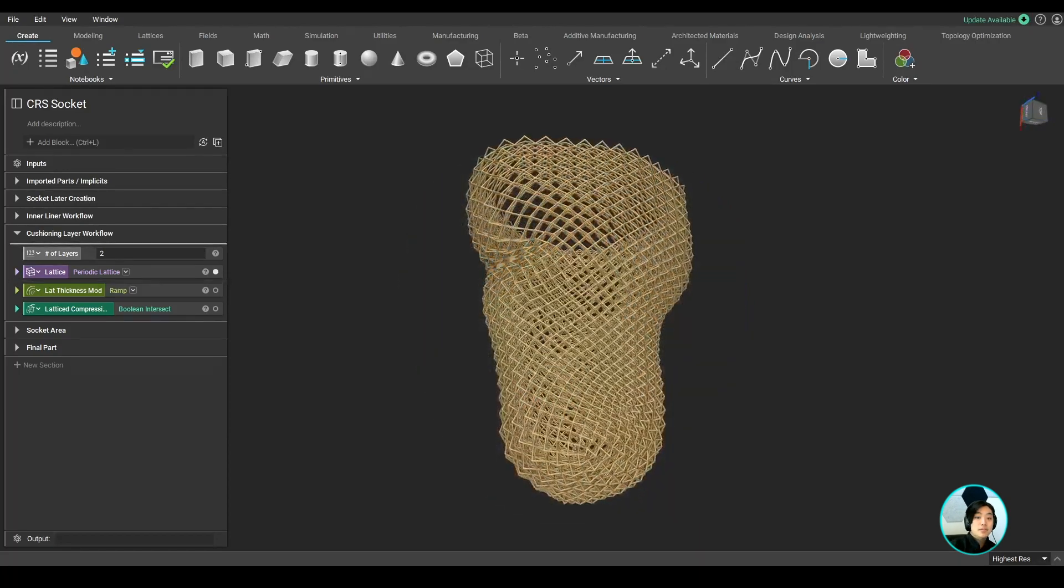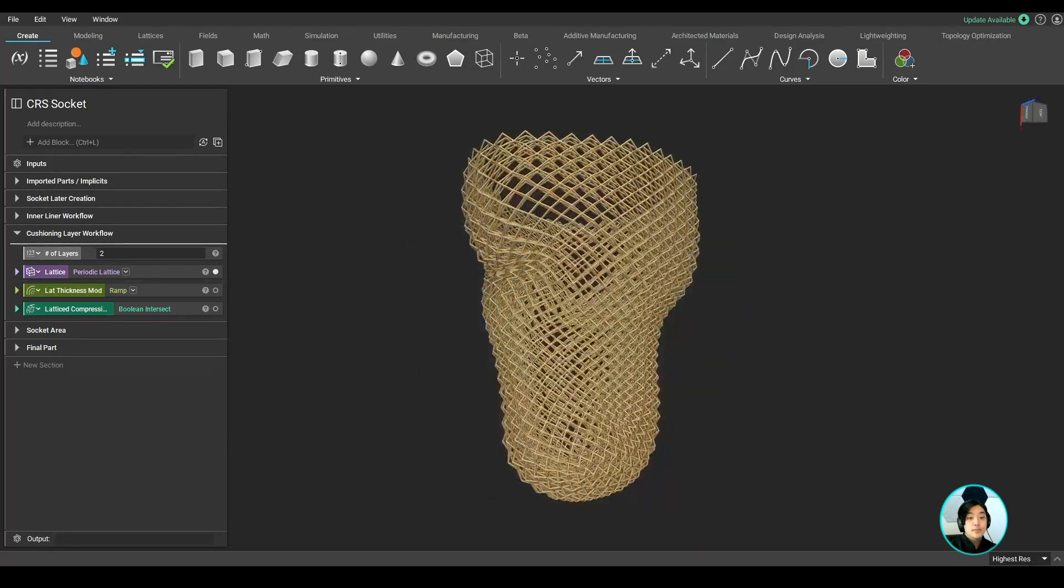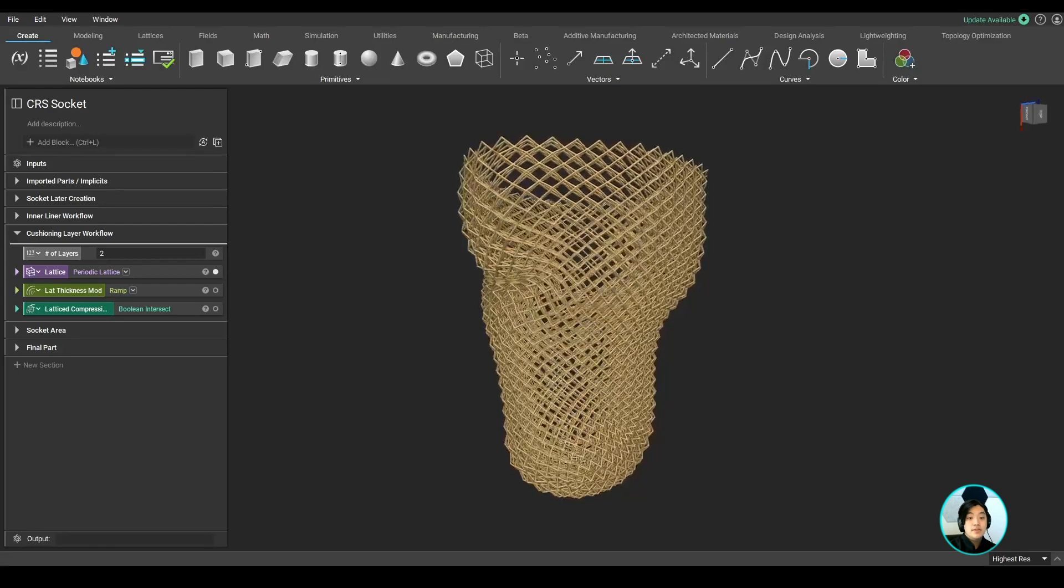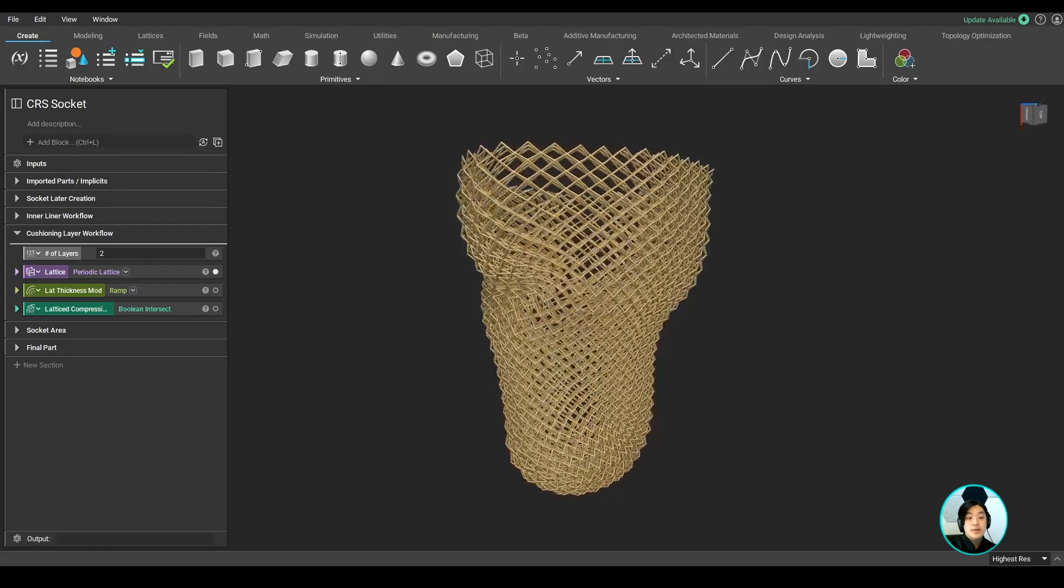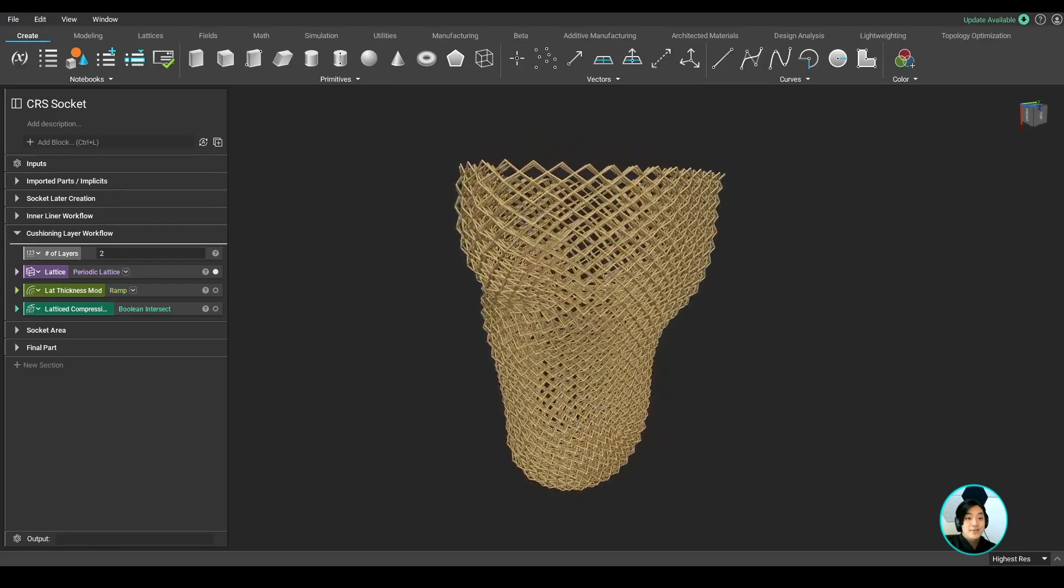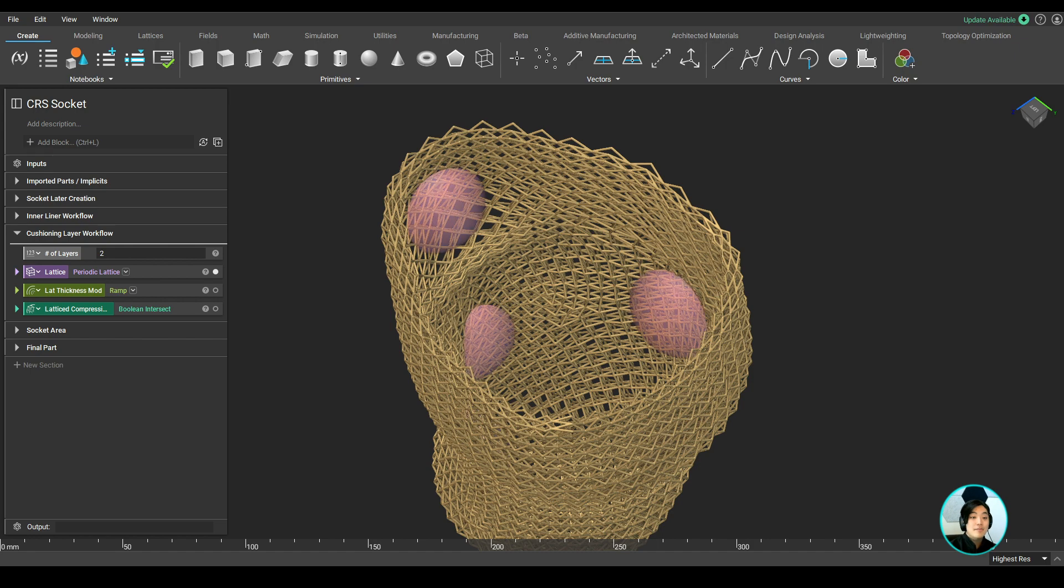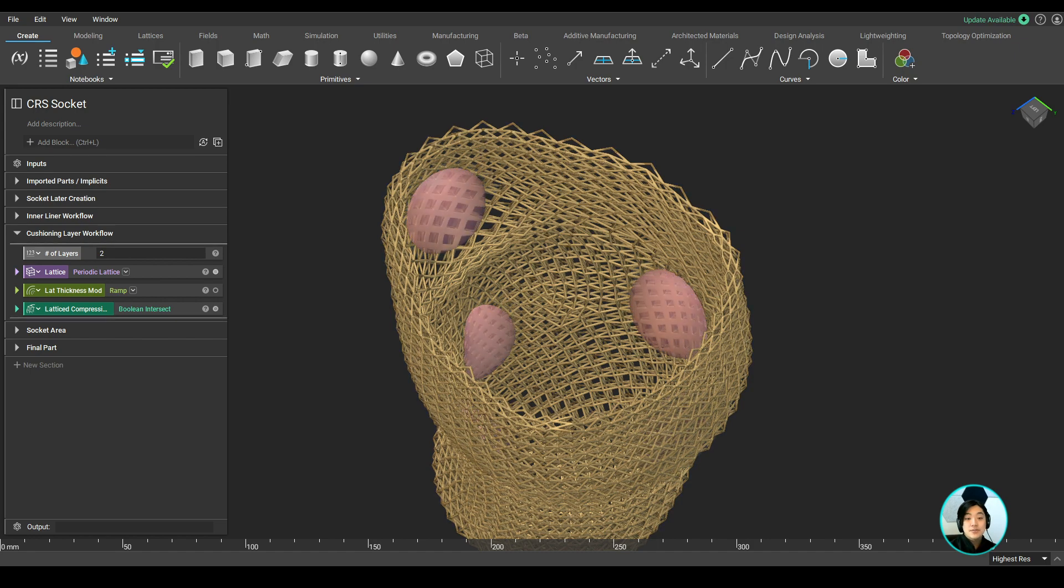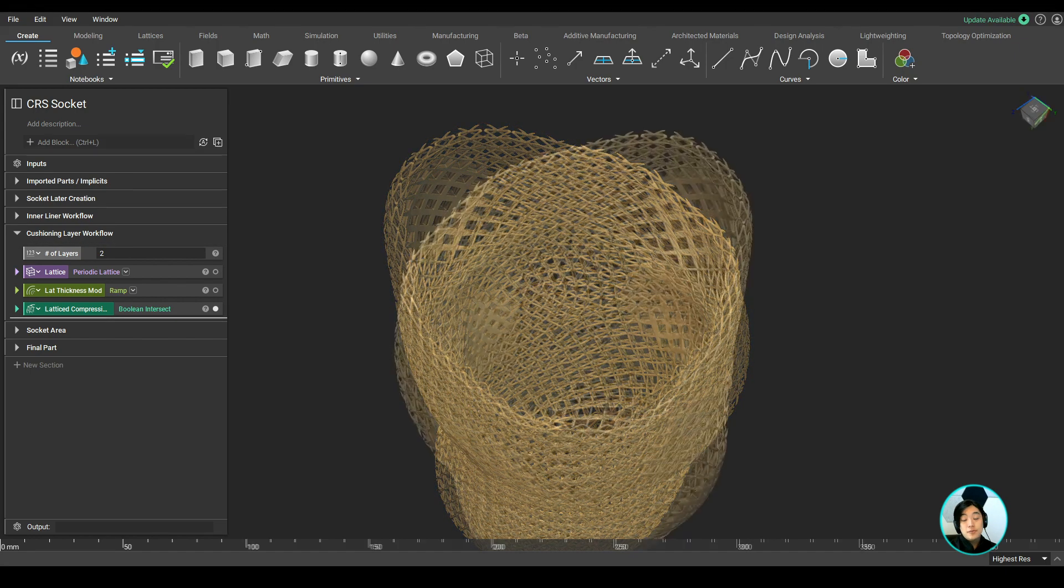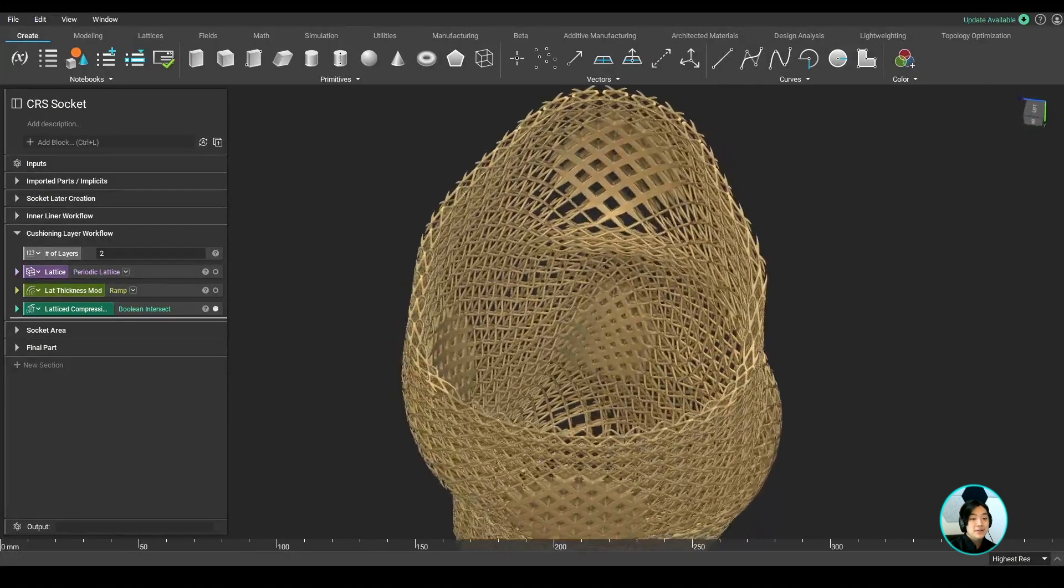Once my lattices are complete, I notice they are currently uniform in thickness, but maybe I want to stiffen certain areas to have a compression and release area. I used the pads to drive my lattice thickness, so the lattices near the pads are thicker, and further away from the pads, they're thinner.